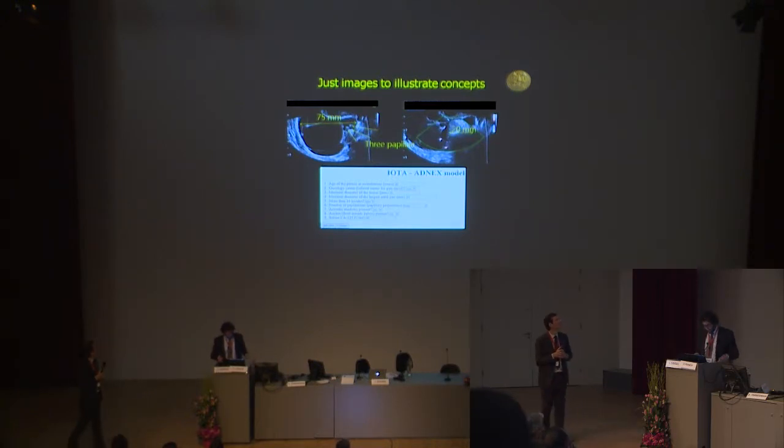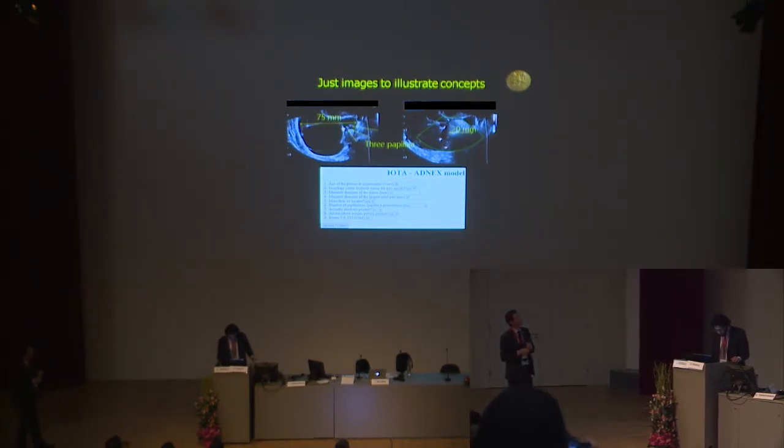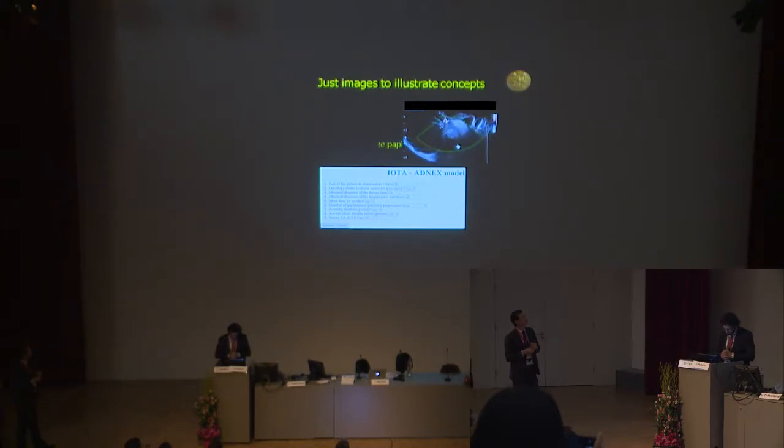Okay. So I want you to guess this one. Lady of 46 years old with an adnexal mass of 75 millimeters maximum diameter, with 3 papillary projections and a solid portion. I will show you the video clips, and this with color Doppler, testifying that that was a solid portion, because I could find some blood vessels in it. No ascites, no acoustic shadows, more than 10 locules, yes.